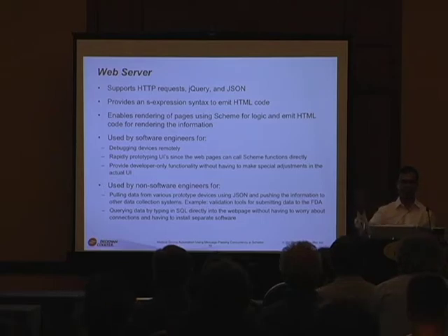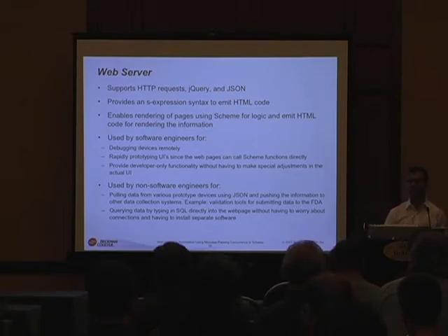So the instrument's in a different part of the country, and we can just log into our network, go access that instrument, and we can even visualize the data. It also gives us the ability to provide some of the UI functionality from a web-based client. That way, we can actually do fast prototyping of UI without having to go through the whole client and making it up and then iterating over it. So we can get some fast iterations on the web and then move it to the actual client, C# client.